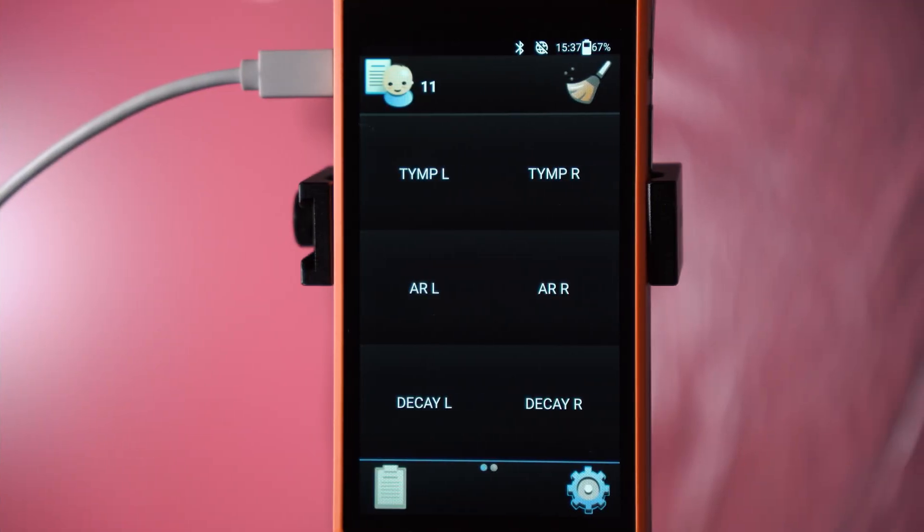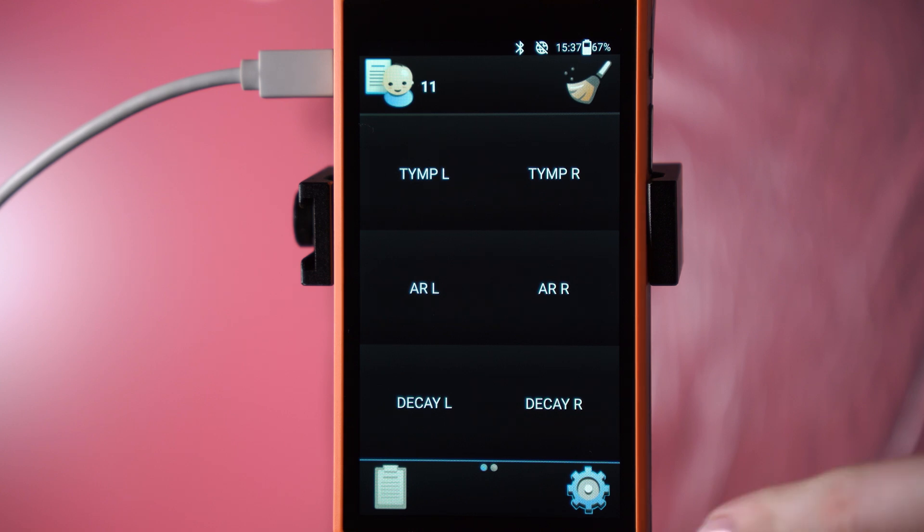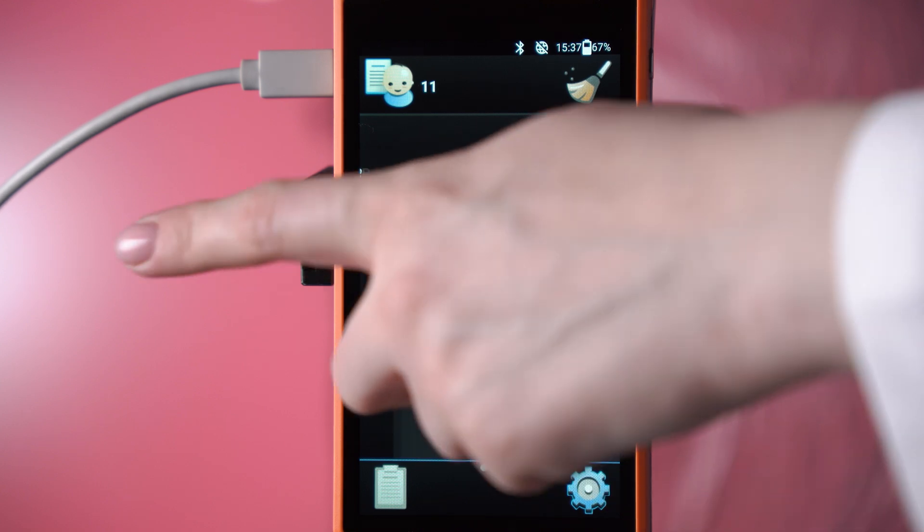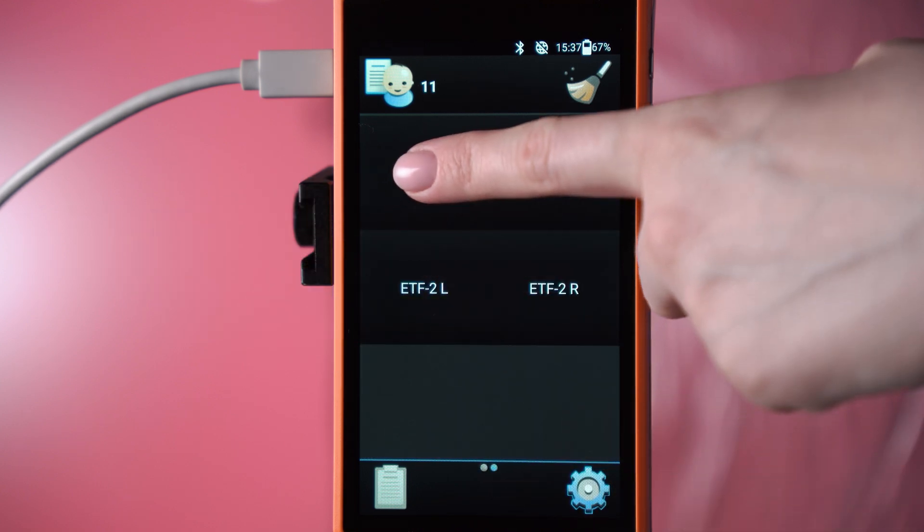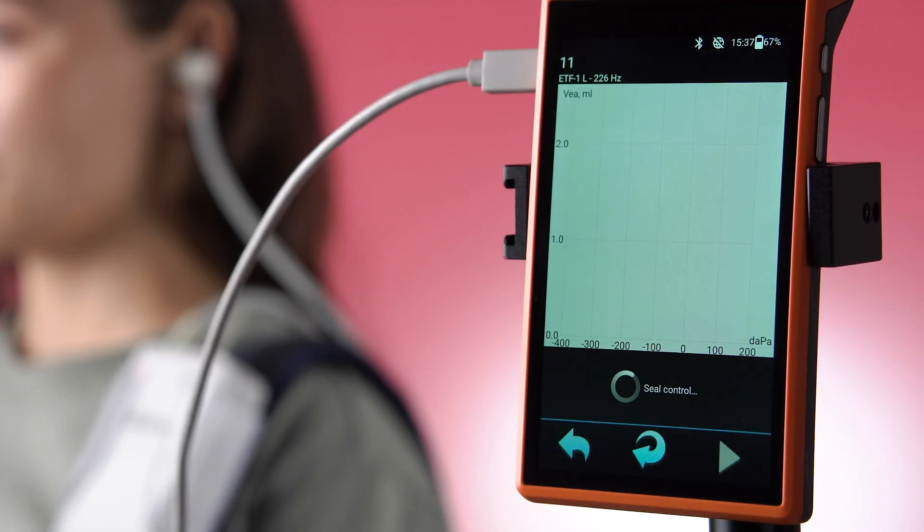Choose the necessary examination: ETF 1L for the left ear or ETF 1R for the right ear, respectively.